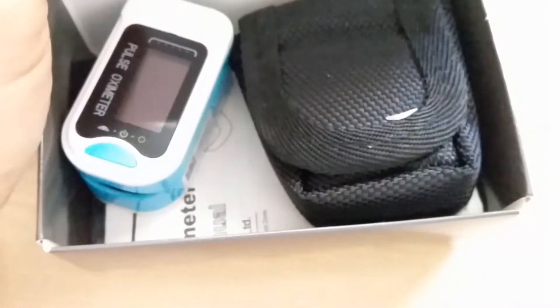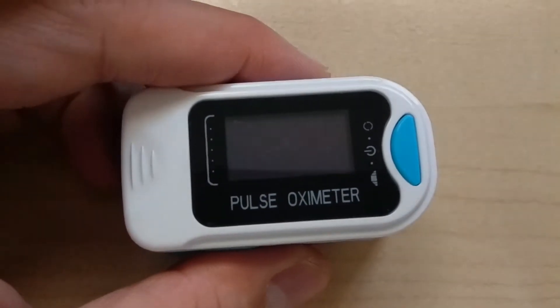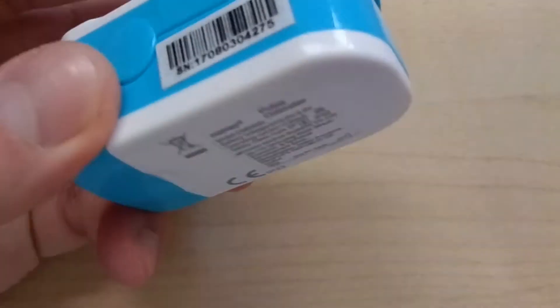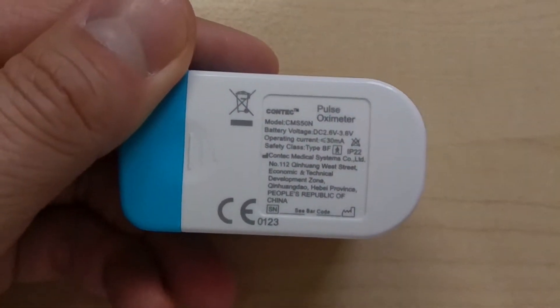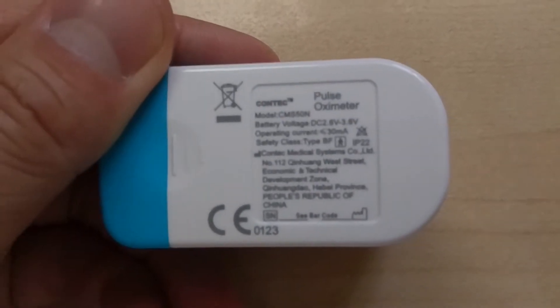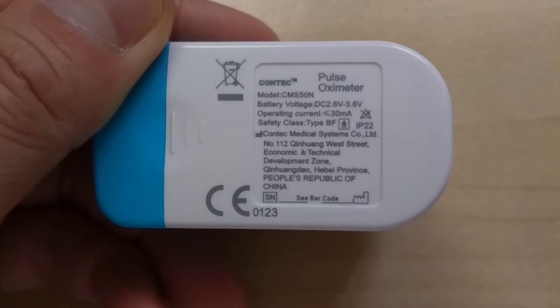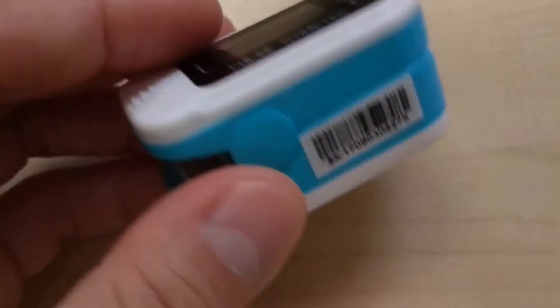You can see there's the pulse oximeter on the left. It's a very simple device. It actually uses two AAA batteries to keep it powered up. On the back it mentions that the battery voltage is 2.6 volt to 3.6 volt, and it's really very small.